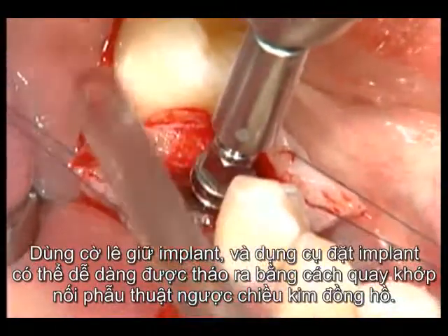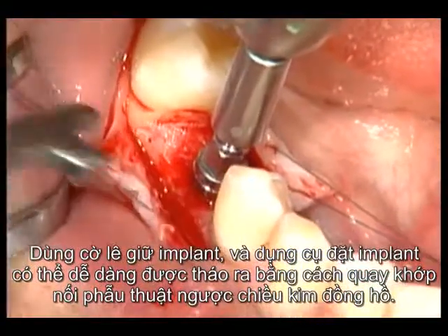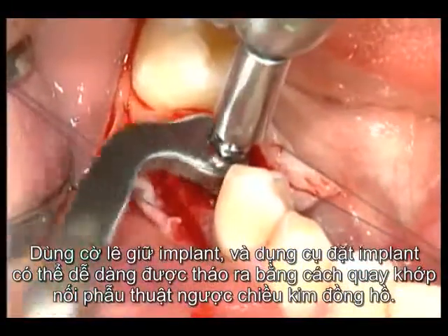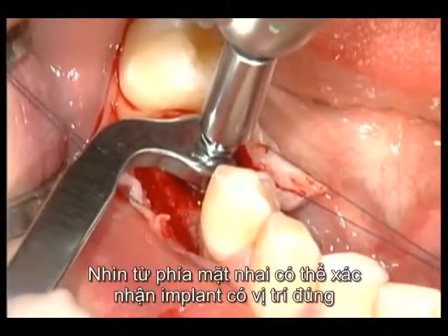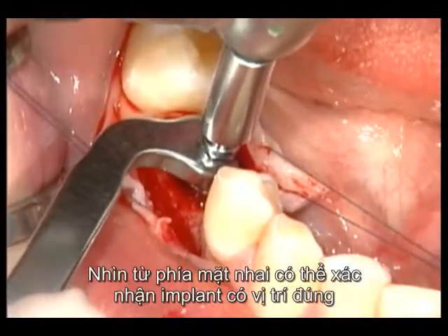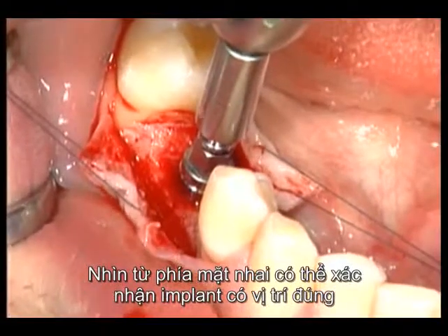The holding key is applied, and the insertion device can be easily removed by rotating the surgical adapter counterclockwise. The occlusal view confirms that the implant is well positioned.